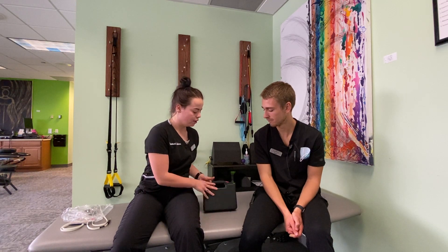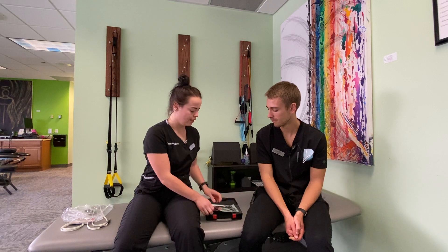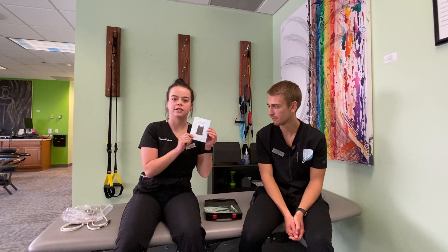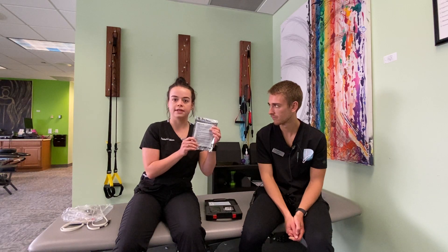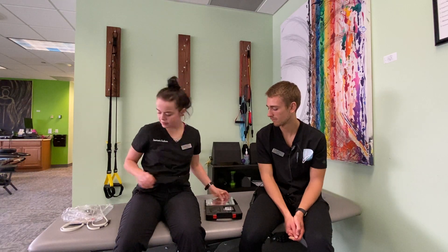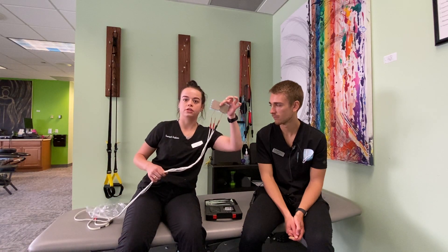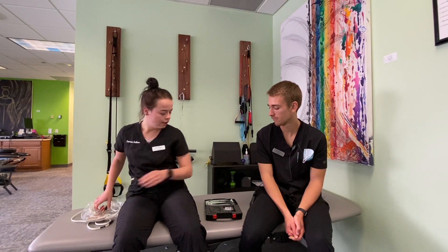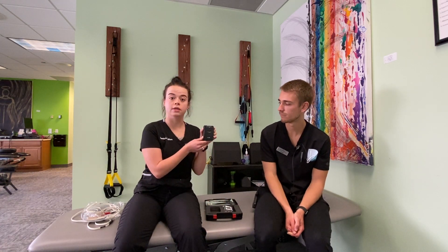When you get your TENS unit, it kind of looks like a briefcase — you open it up. One of the first things you'll see is just an instruction manual. You'll get your own set of e-STIM pads or TENS unit pads. They kind of look like these pads right here, just a tad bit smaller. You're also going to get your own set of wires and then your actual TENS unit.